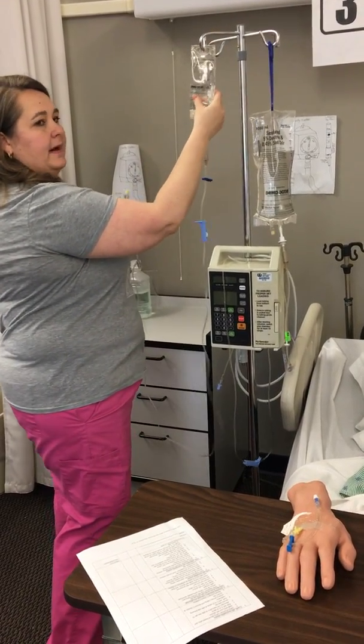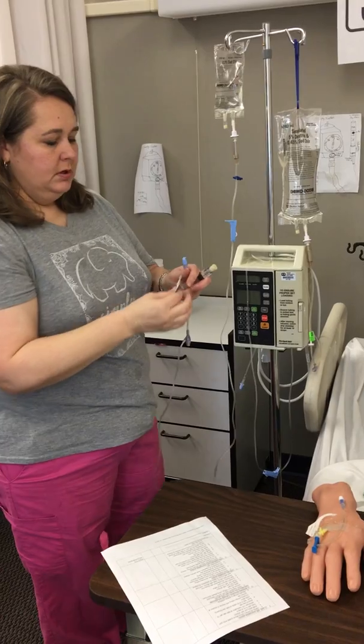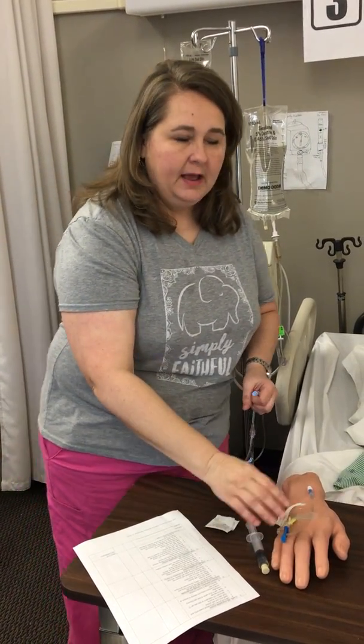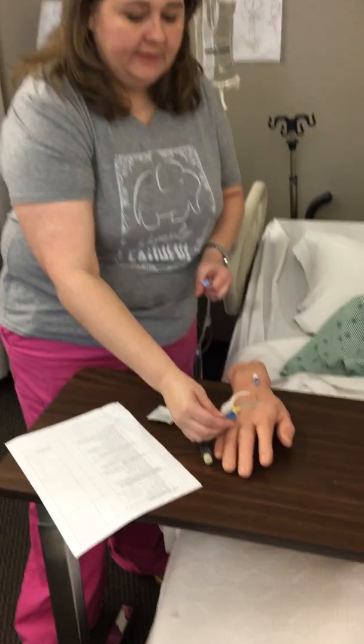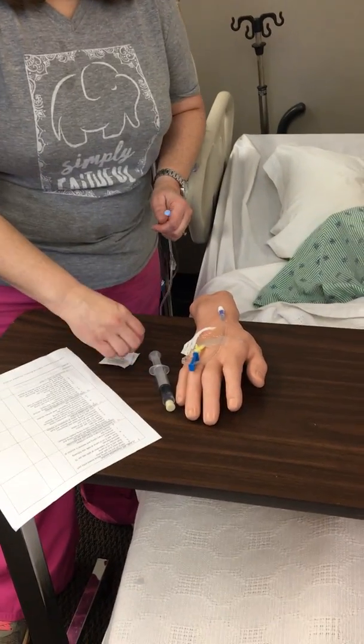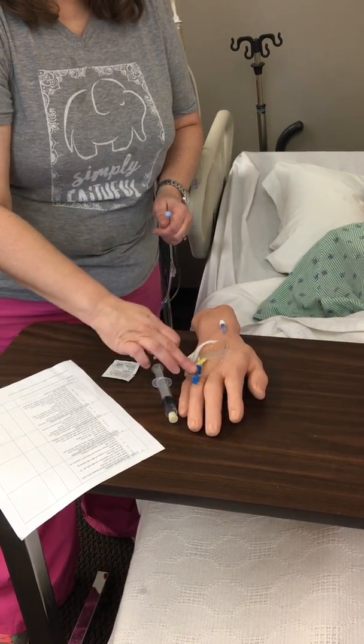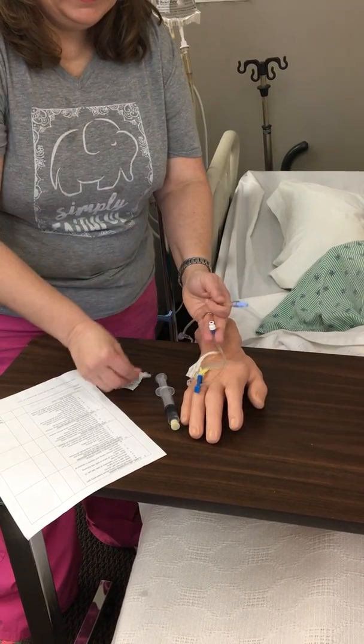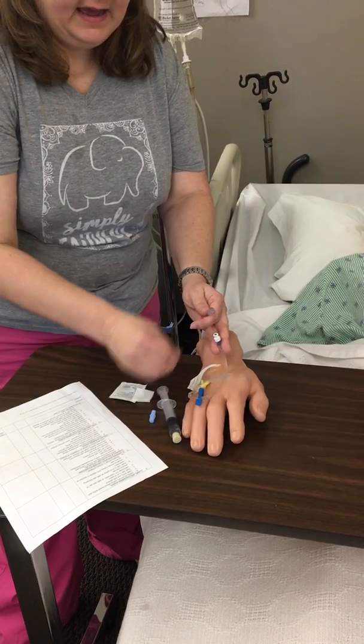This is my IV piggyback medication, and it's correctly labeled. And I have my flush. I want to inspect my site just like I have with every IV skill that I've done. I'm going to unclamp my extension set here. I'm going to swab my port on my INT. I'm going to disconnect this cap.